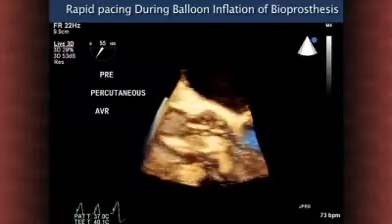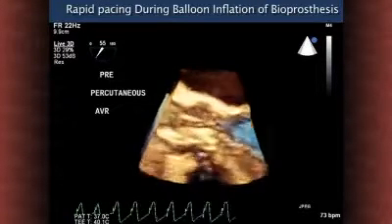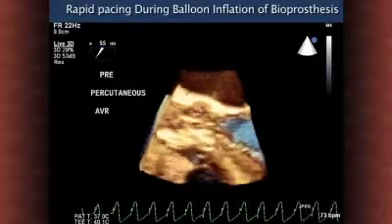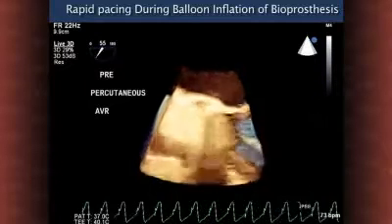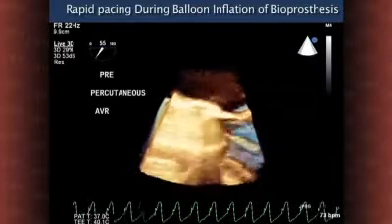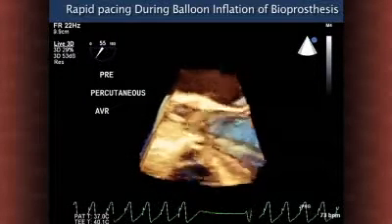And during the procedure, the process of placing the valve in exactly the right place, exactly within the annulus of the patient, in the mid to upper portion of the crimped valve, for example, and then immediately on expansion of the valve, looking for aortic regurgitation and for the proper placement of the valve. Those are very important monitoring things that are very similar to other procedural echocardiograms that have been used elsewhere.